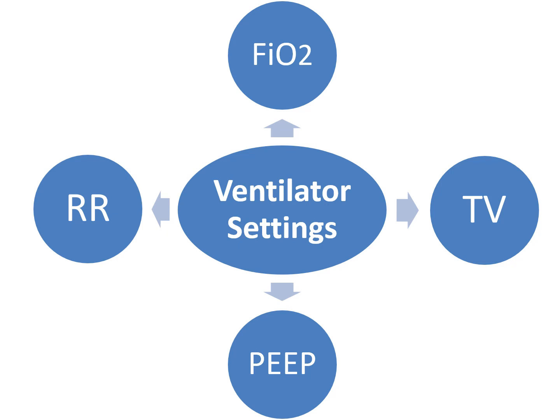The goal is to adjust the FiO2 to keep the saturation greater than 90% and your PO2 greater than 60 millimeters of mercury. But again, you should review your hospital policy for the RT's ability to make adjustments according to the saturation. The goal is to maintain adequate saturation with the minimum amount of FiO2, so that you do not cause any oxygen toxicity.